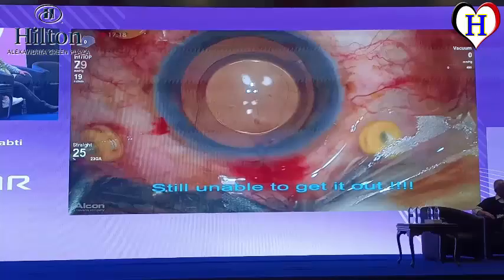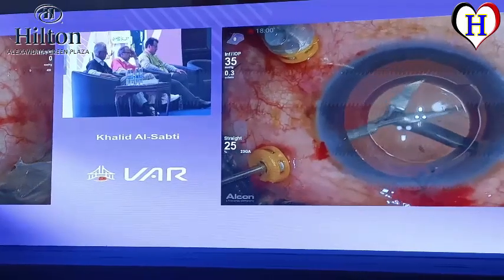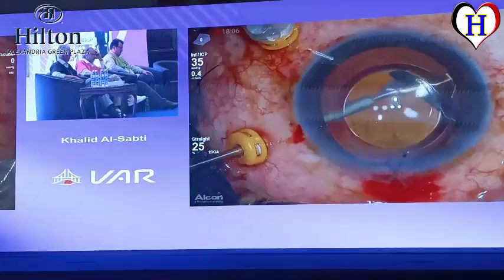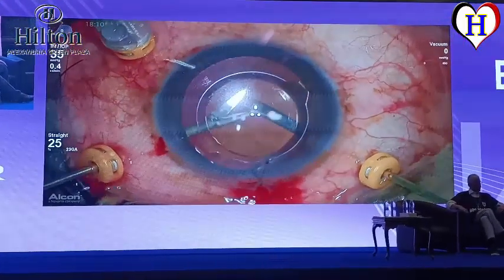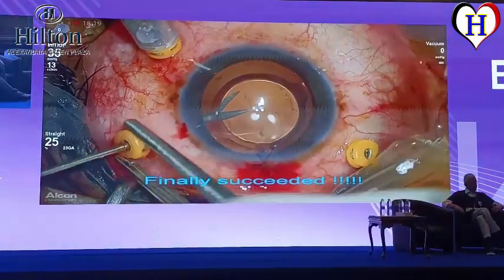This seems to be more traumatic and may cause serious damage. Therefore, reversing the locking mechanism would be a better option. I had to unlock the blade by placing the light pipe between the blade and turn the scissor handle clockwise while squeezing the handle. This trick solved the problem and the locking mechanism was reversed. Finally, the scissor was removed without any undesirable complications.